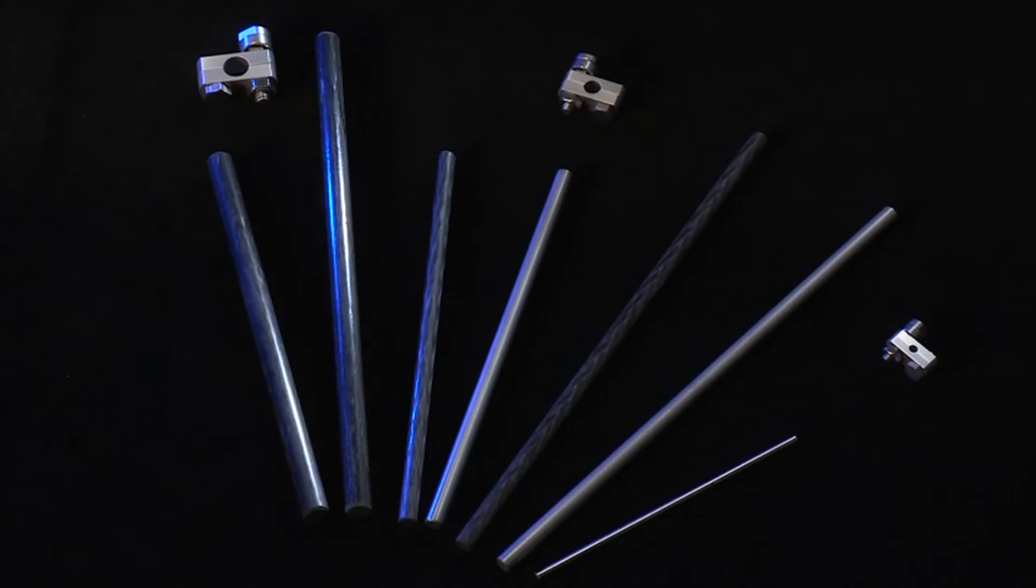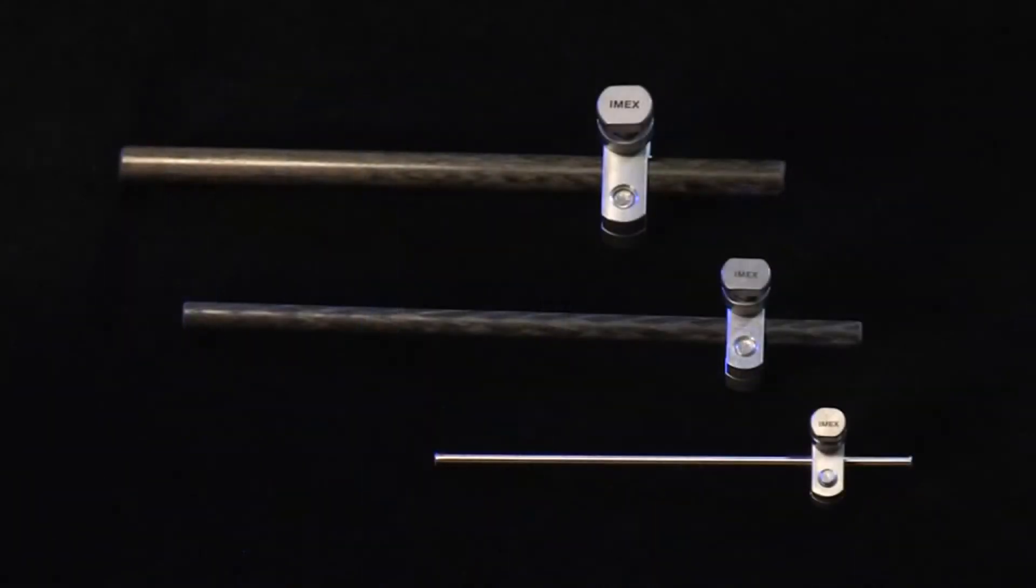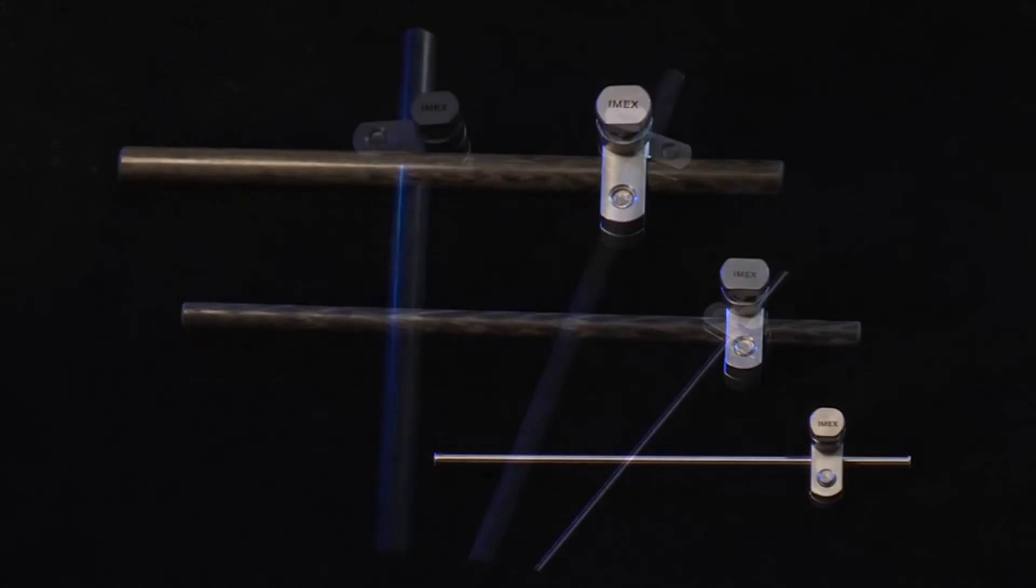The revolutionary design of the SK fixator is based upon the use of larger connecting rods made of strong lightweight materials combined with pin gripping clamps that support the use of multiple pin diameters and simplify the use of modern fixation pins.